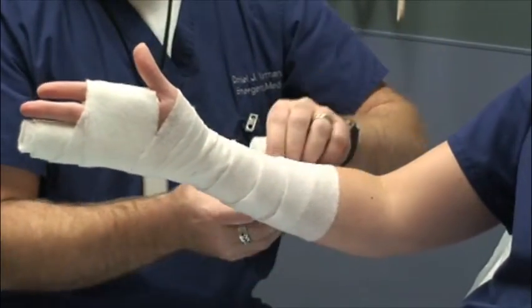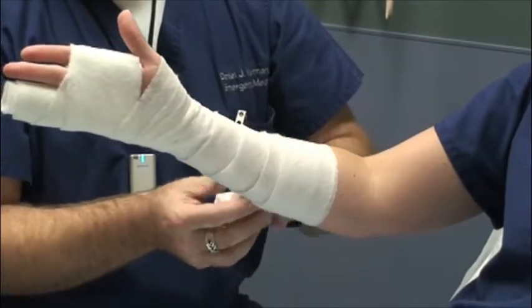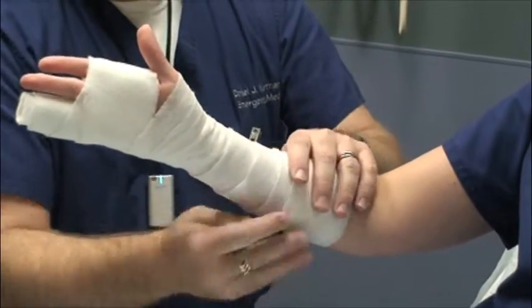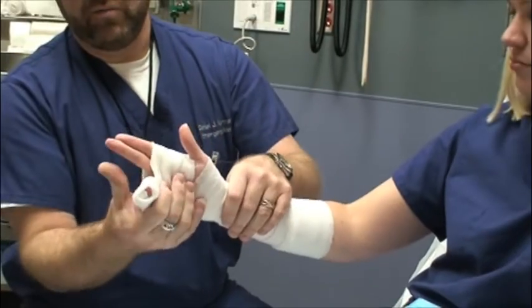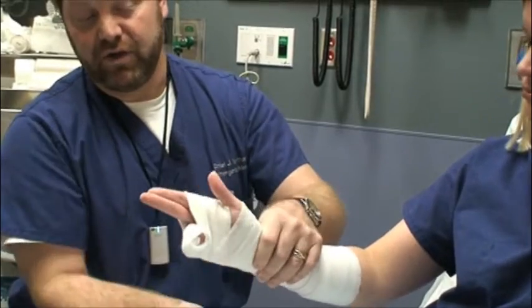This one we're going to go basically 3 quarters of the way up the forearm, then end with a few extra wraps at the top, tearing off and smoothing down. Check that as you put the hand in the position of function: bend the wrist back, bend the metacarpal joints somewhere between 50 and 90 degrees, and the proximal phalangeal joint at 20 degrees — though some authors say to keep it straight. Make sure you don't have huge bumps in your wrap when you do that.